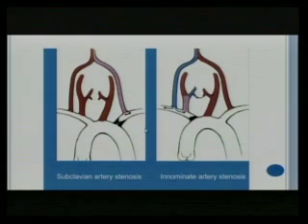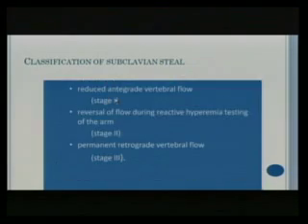So this is the subclavian artery. Now on the right side where you have the innominate trunk, the same principles apply. Only thing is that the stenosis is happening proximal, that is at the innominate level. When it happens at the innominate level, you still have the subclavian artery and the carotid artery coming off, but the subclavian artery comes off the innominate artery, and therefore the vertebral artery serves as a collateral to supply that subclavian artery distal to the takeoff of the vertebral artery.